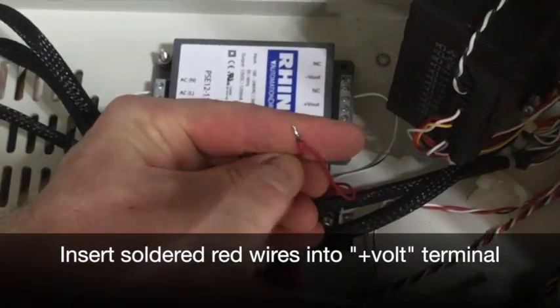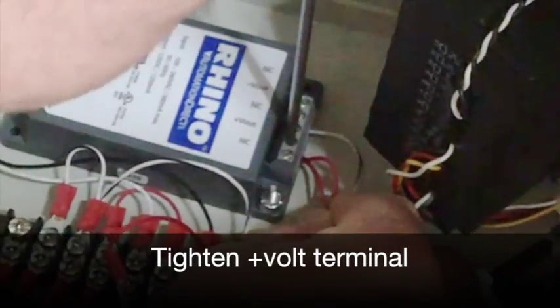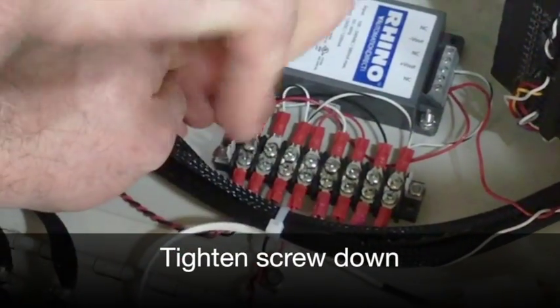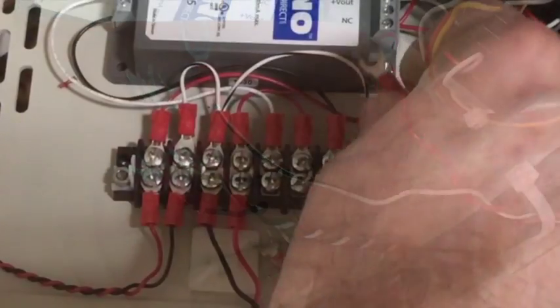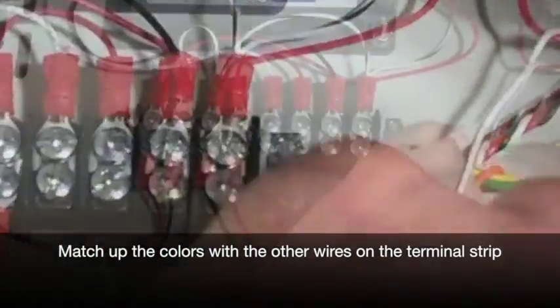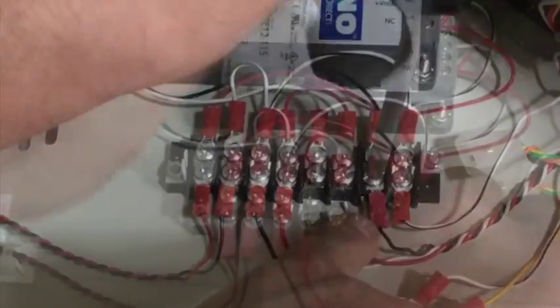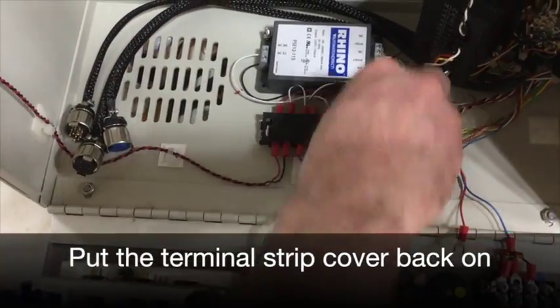Insert the 2 soldered red wires into the plus volt terminal, and then tighten the terminal down with your flathead screwdriver. Insert the other half of the red wire with the wire terminal lug on it into the last wire terminal on the end and tighten down. Find the white, red, black, and white, black wires and then match up the colors to the other wires on the terminal strip, making sure to tighten all 4 terminals, like this. Put the terminal strip cover back on.